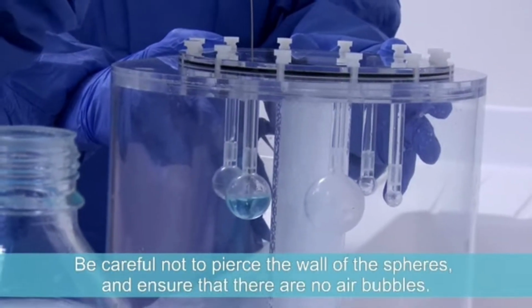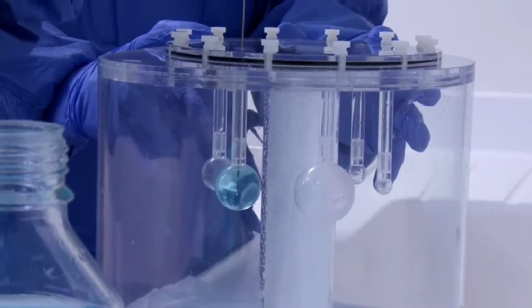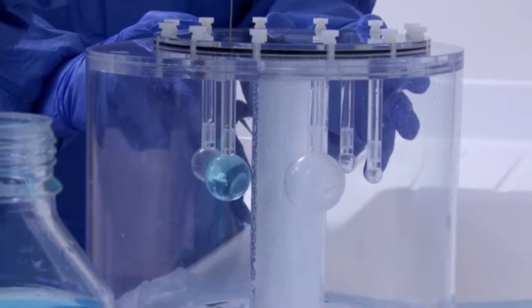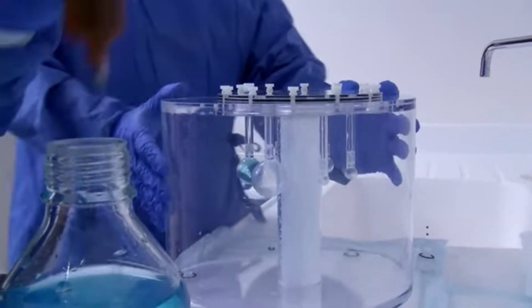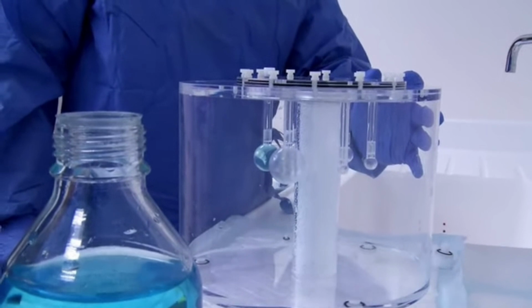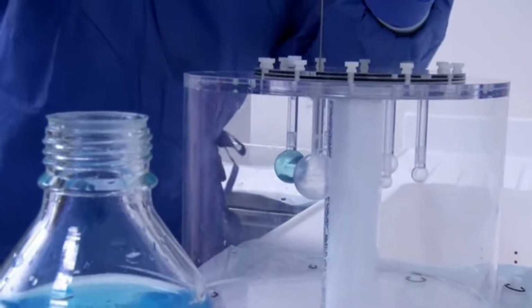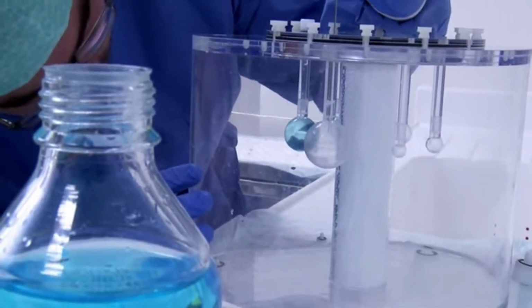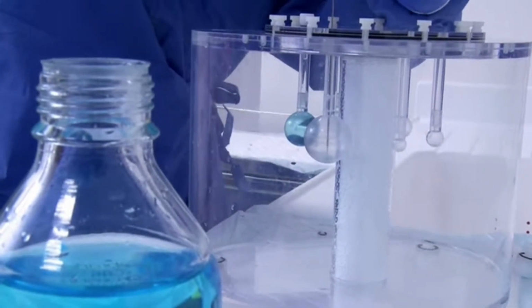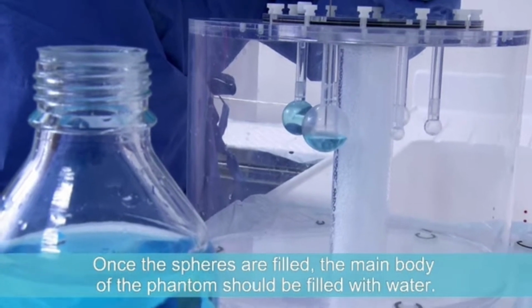Be careful not to pierce the wall of the spheres and ensure that there are no air bubbles. Once the spheres are filled, the main body of the phantom should be filled with water.